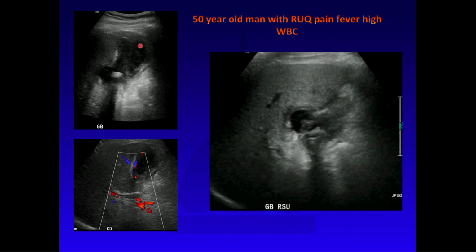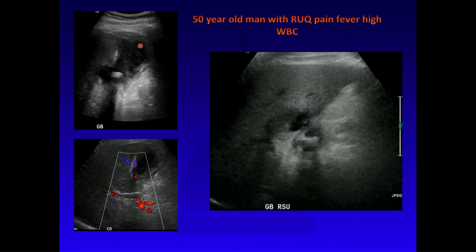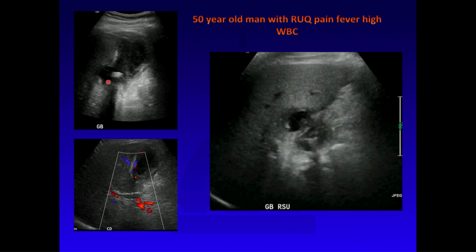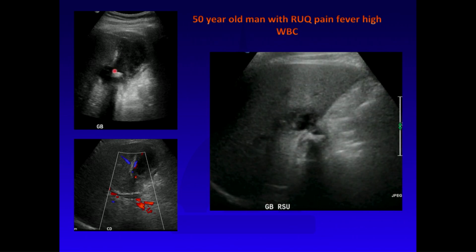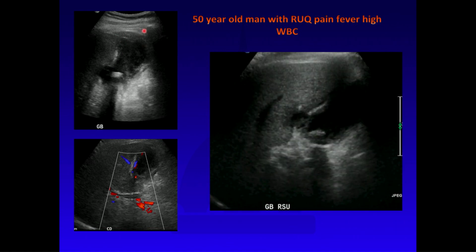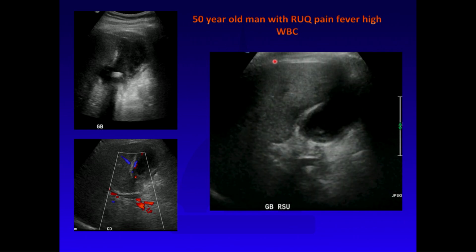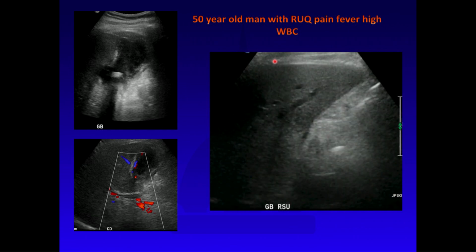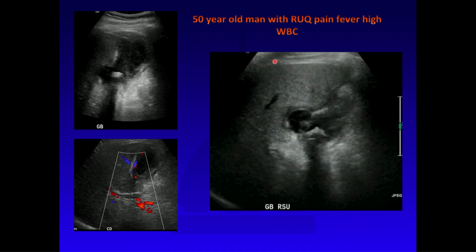The gallbladder should be oval. So even if the patient has acute cholecystitis, the gallbladder is distended, but it should be oval in shape. And there is a focal outpouching. The other thing that is noticed is the wall of the gallbladder, which should normally be echogenic. You don't see that echogenic line here, and you don't really see the echogenic line in the fundus either. So the fact that he has a negative sonographic Murphy sign doesn't dissuade me from the diagnosis. In this patient, I'm highly suspicious that the patient has acute cholecystitis with perforation.